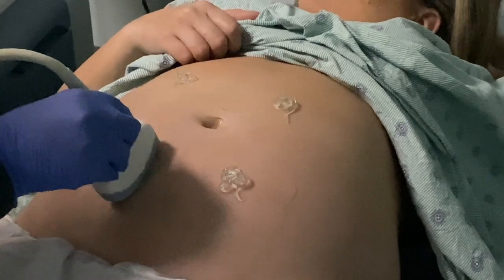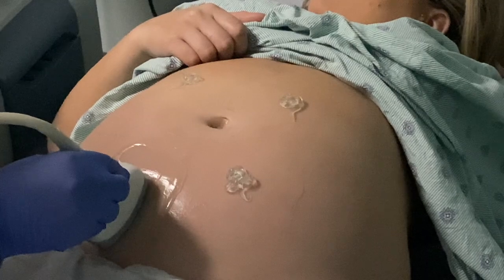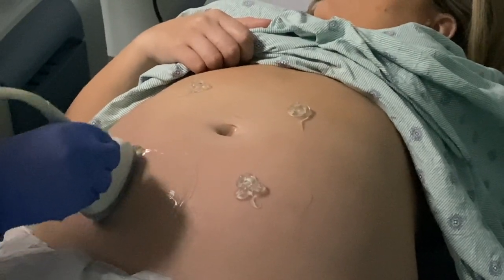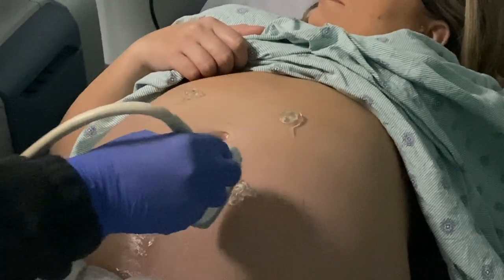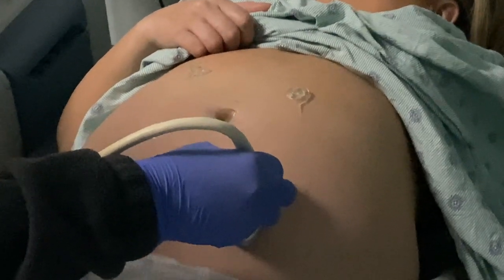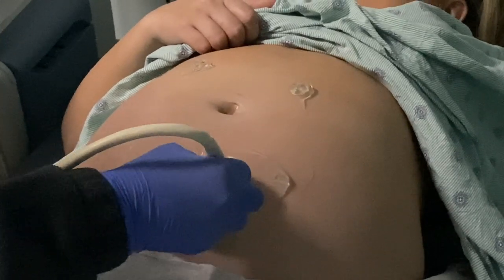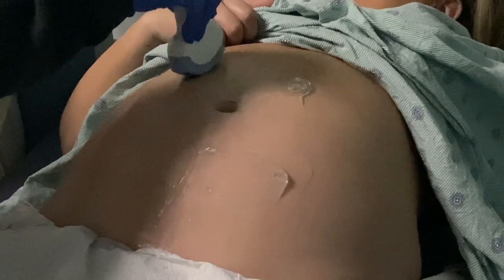Begin by mapping the uterine cavity with transducer orientation in sagittal plane and perpendicular to the floor. Imagine the maternal abdomen in 4 quadrants and that you need to interrogate all 4. Begin by placing transducer in one of the quadrants and scanning in sagittal orientation. Repeat this step in all quadrants.